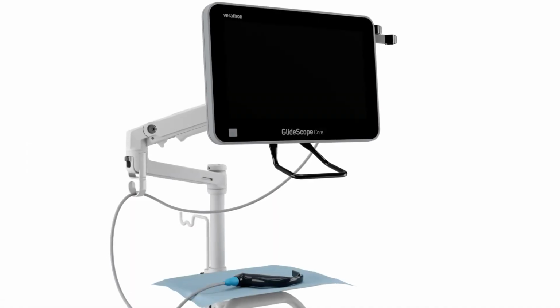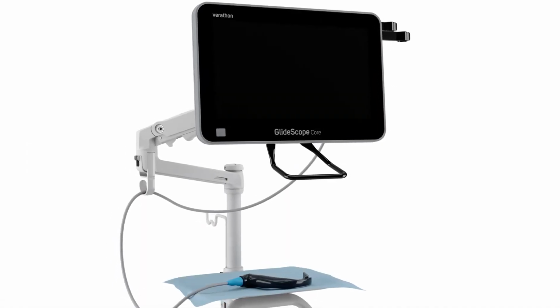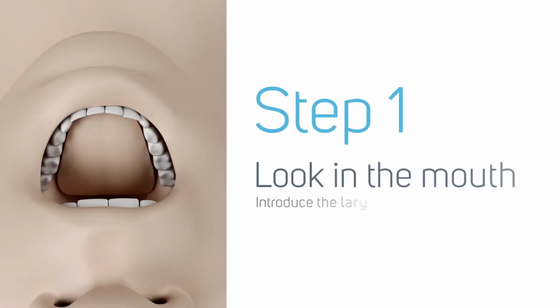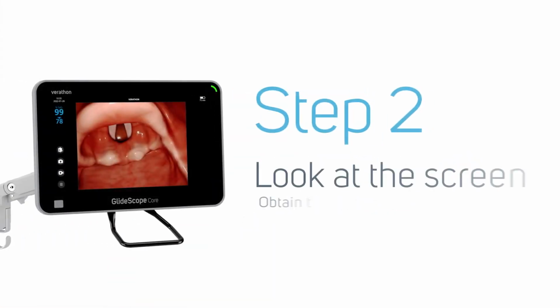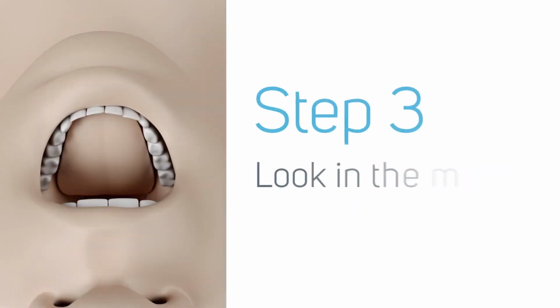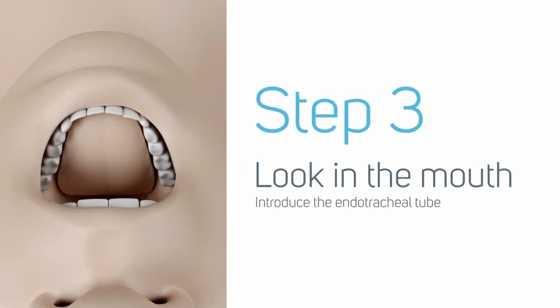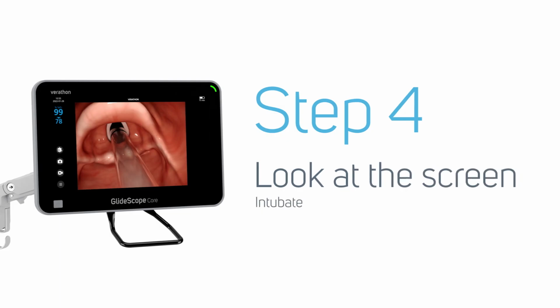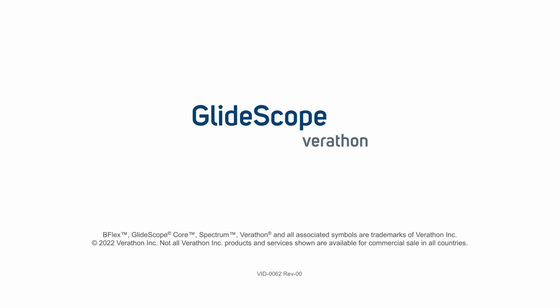To review, the 4 steps to successful GlideScope hyperangulated videolaryngoscopy are: 1. In the mouth to introduce the laryngoscope. 2. At the screen to obtain the best glottic view. 3. In the mouth to introduce the endotracheal tube. And 4. At the screen to intubate. GlideScope hyperangulated videolaryngoscopes.